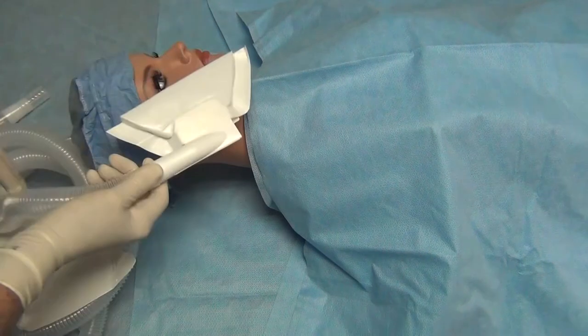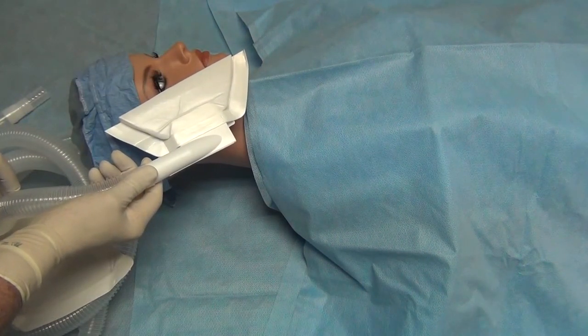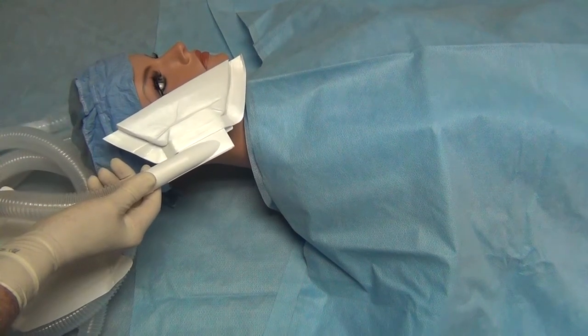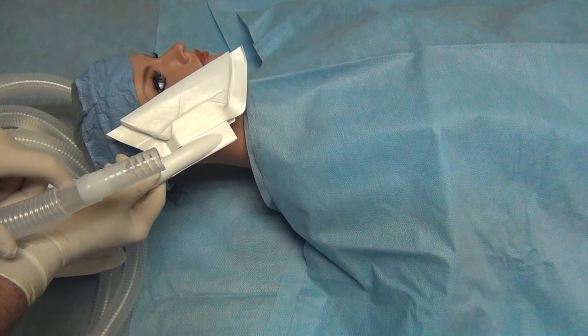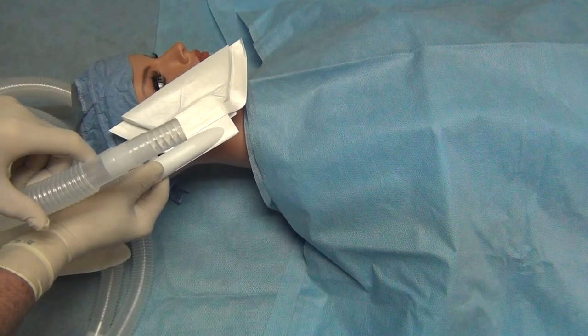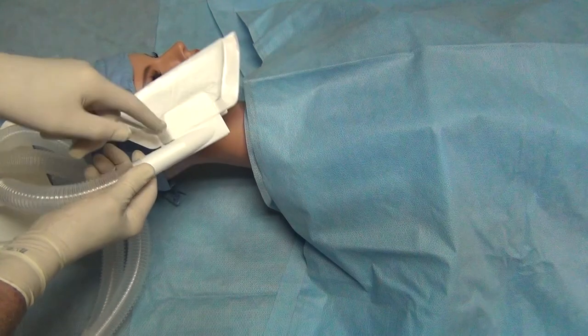Removal of the release paper. Place it on the skin or close to the mouth and the nose. Leave it on. Place it on suction before you go ahead and intubate or put in a bronchoscope. Leave it on the suction until you're done with the procedure and then it will peel right off.